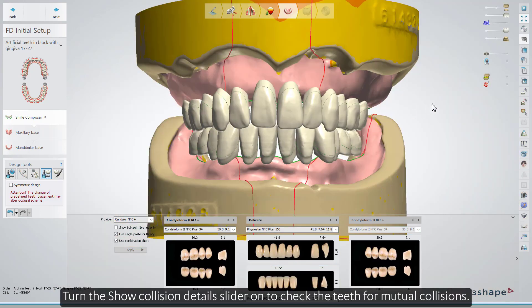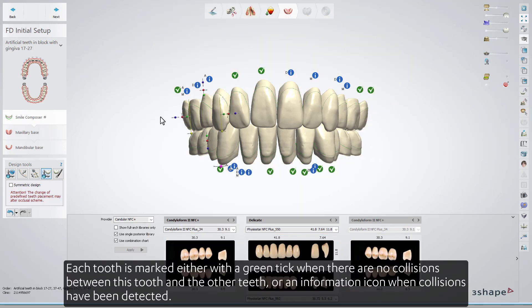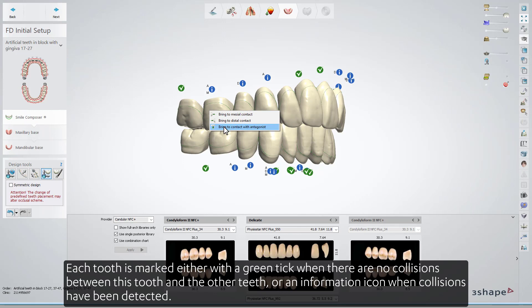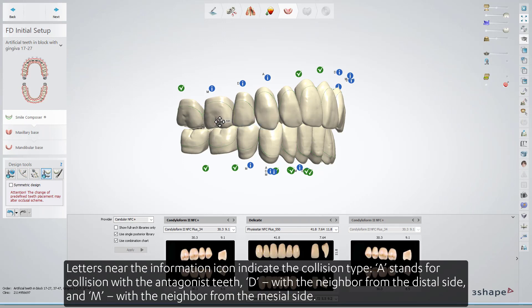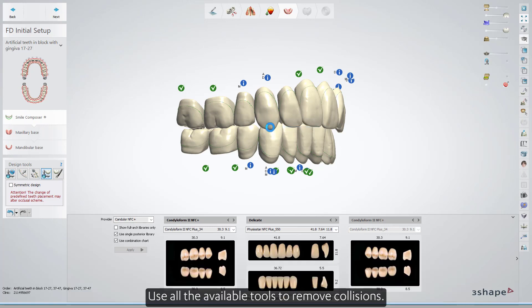Turn the Show Collision Details slider on to check the teeth for mutual collisions. Each tooth is marked either with a green tick where there are no collisions, or an information icon when collisions have been detected. Letters near the information icon indicate the collision type: A stands for collision with the antagonist teeth, D with the neighbor from the distal side, and M with the neighbor from the mesial side. Use all the available tools to remove collisions.